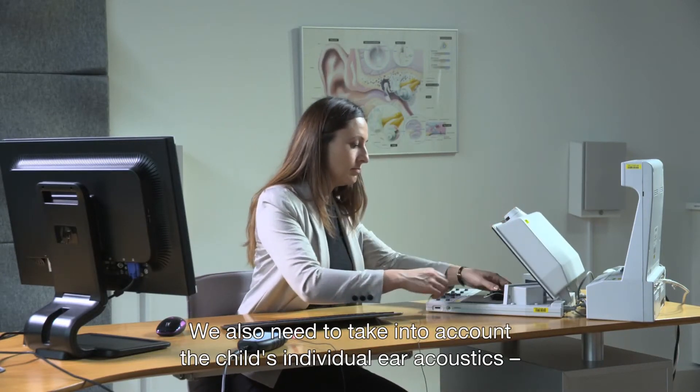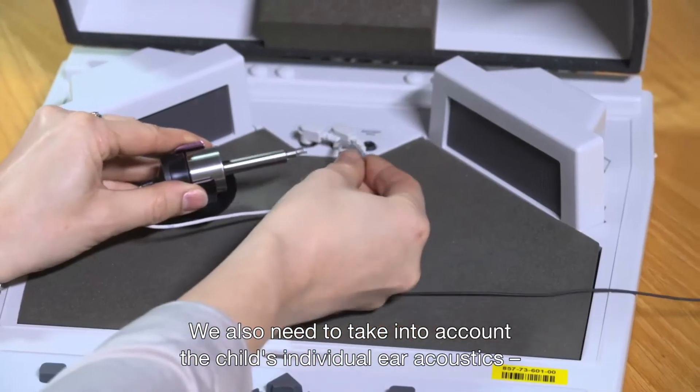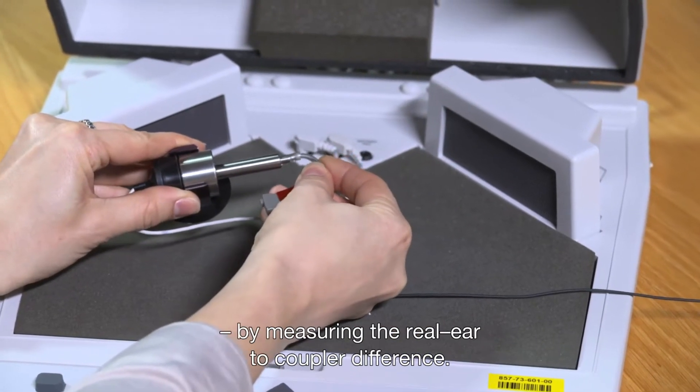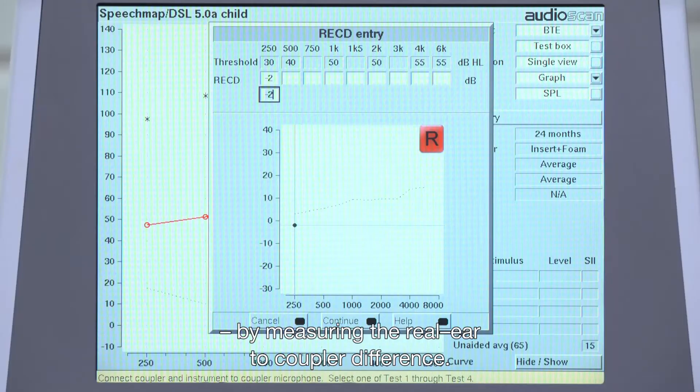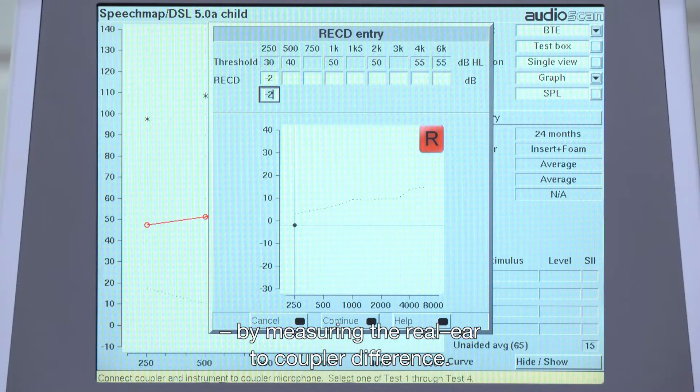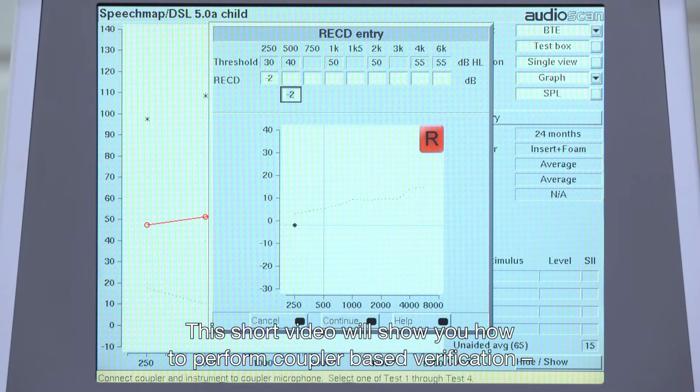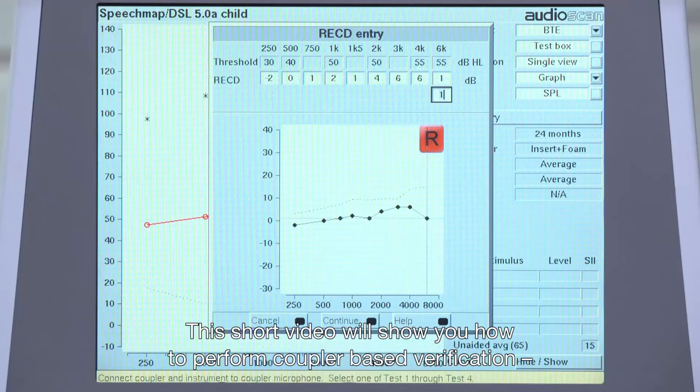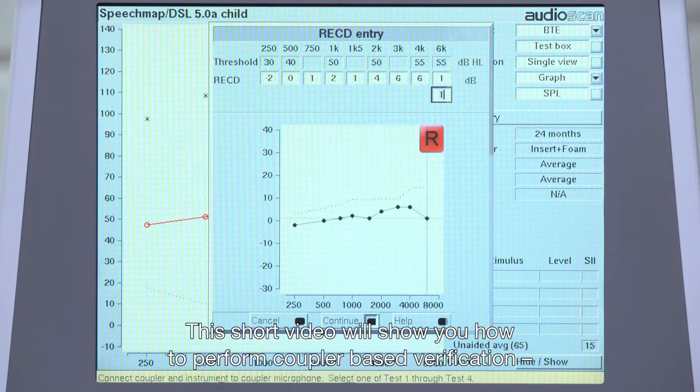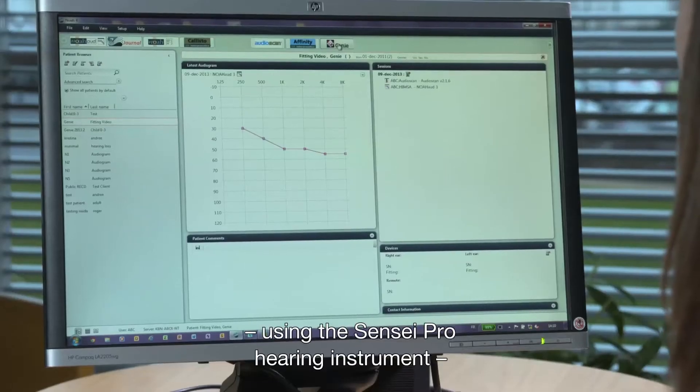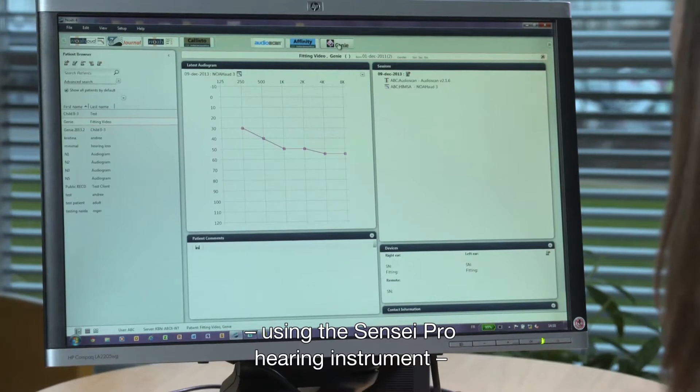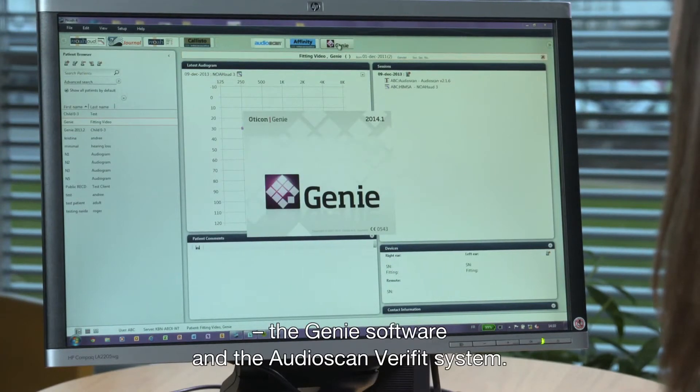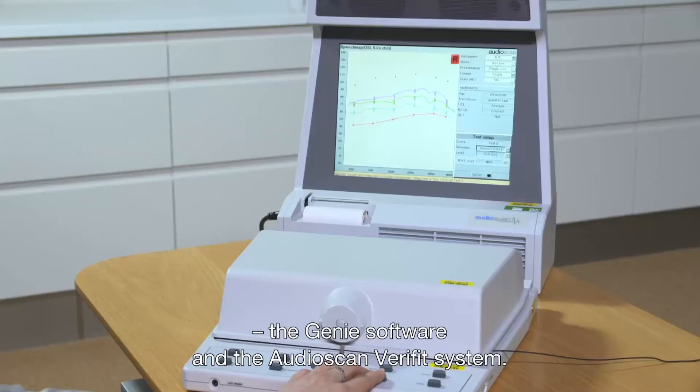We also need to take into account the child's individual ear acoustics by measuring the real ear to coupler difference. This short video will show you how to perform coupler-based verification using the Sensei Pro hearing instrument, the Genie software, and the AudioScan Verifit system.